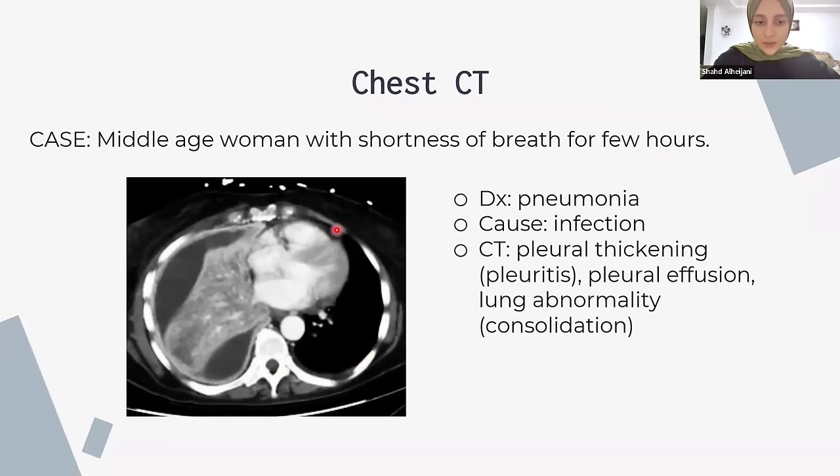And the lung is covered by something. What do we call the covering of the lung? Fluid, yes. Okay, someone asked, could this be pneumothorax? No, in pneumothorax, what happens is you have penetration, then air will be surrounding the lungs and the lung will shrink. In this case, you can't really see it. And we said for pneumothorax, usually if you suspect the patient has tension pneumothorax, you do an X-ray, not a CT. So in this case, you did a CT and you see all those abnormalities. You have different attenuations, different things going on. In pneumothorax, it's mainly air. Air is supposed to look dark. It won't look different shades of gray here.